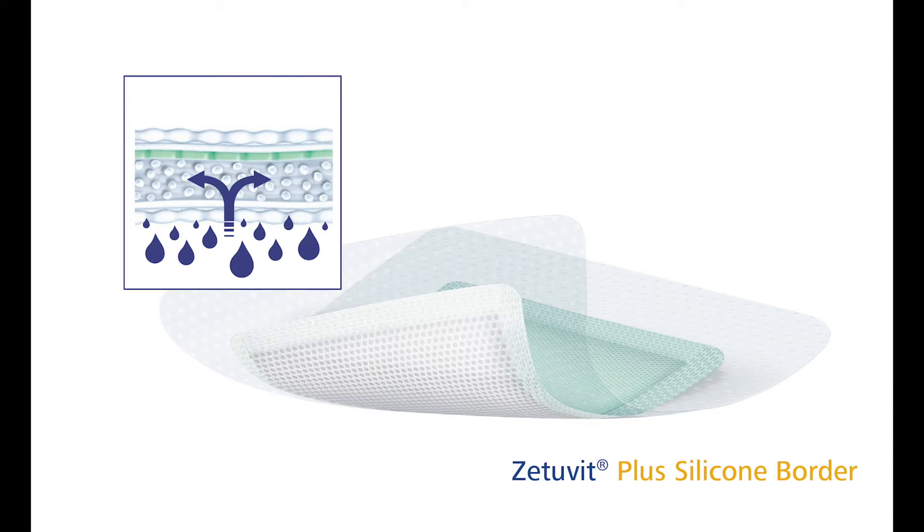The semi-permeable backing film provides a barrier against water as well as bacteria and viruses. The silicone contact layer and border are gentle to the skin and wound while enabling an atraumatic removal.